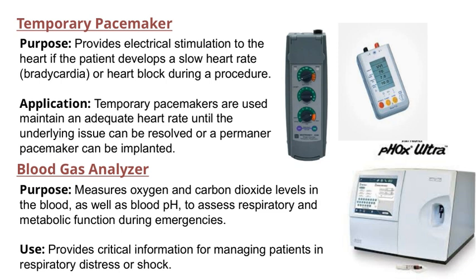These devices are used to maintain an adequate heart rate, giving the medical team time to either resolve the issue or plan for a permanent pacemaker if needed. It's a crucial intervention in acute settings to prevent complications from a dangerously slow heart rate.